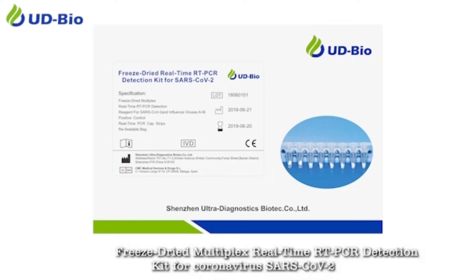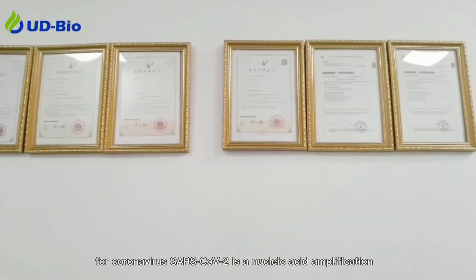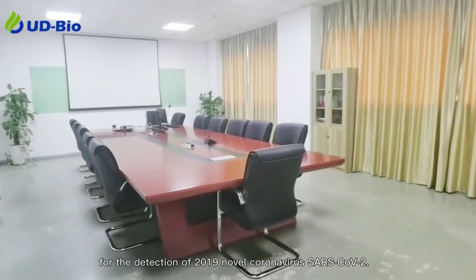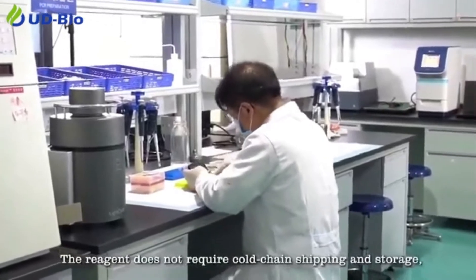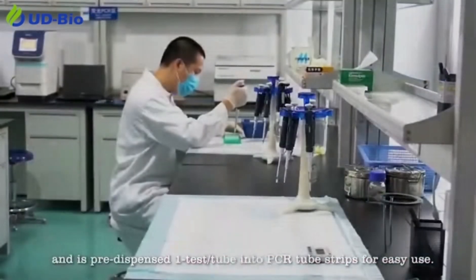The Freeze-Dried Multiplex Real-Time RT-PCR Detection Kit for Coronavirus SARS-CoV-2 is a nucleic acid amplification test reagent that contains all necessary components for the detection of 2019 novel coronavirus SARS-CoV-2. The reagent does not require cold-chain shipping and storage, and is pre-dispensed into PCR tube strips for easy use.